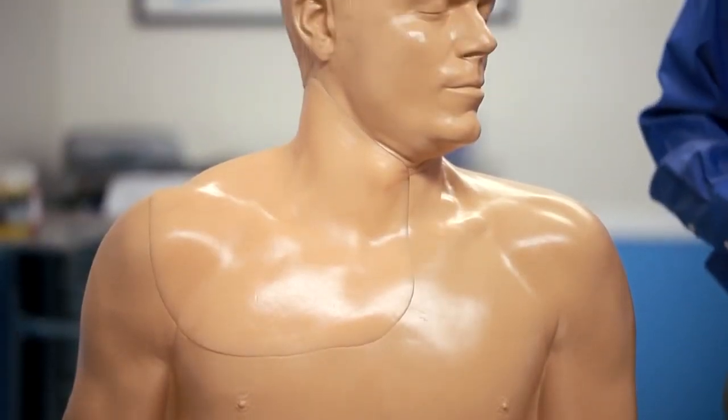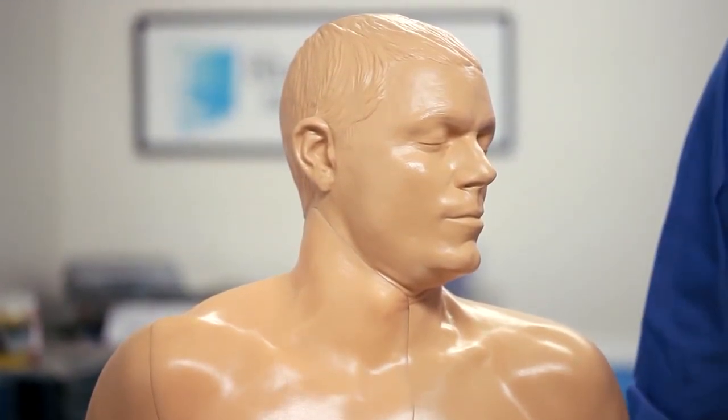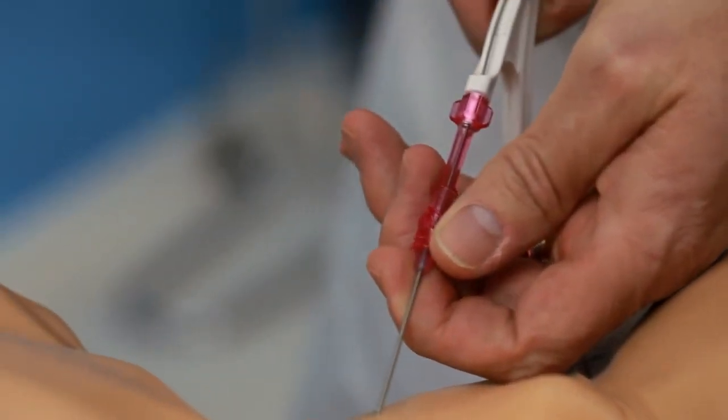The CAE BluePhantom Gen2 Ultrasound Central Line Training Model is a mannequin designed for learning and practicing realistic central line placement.